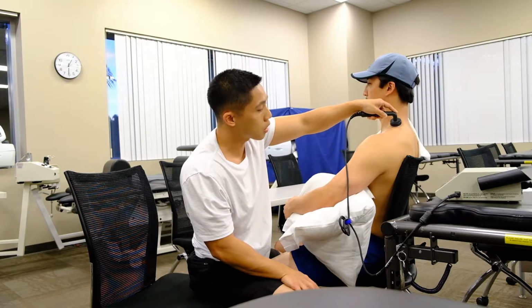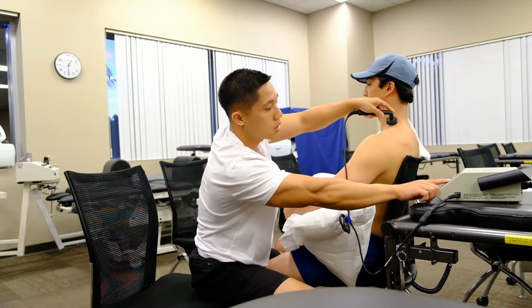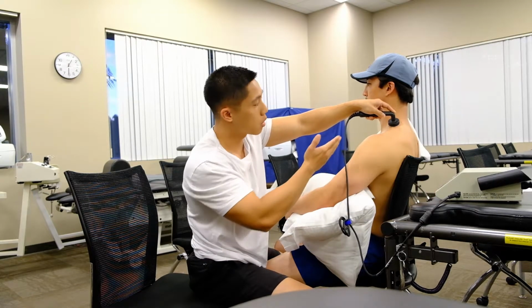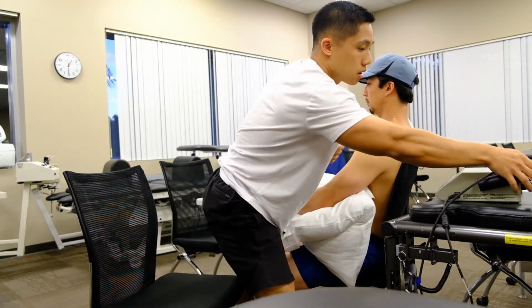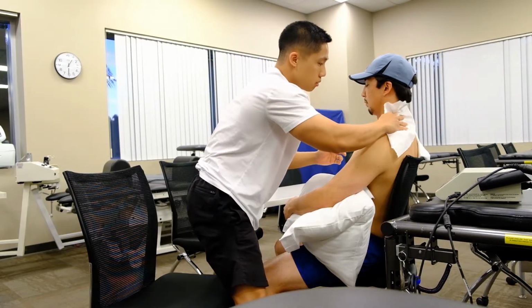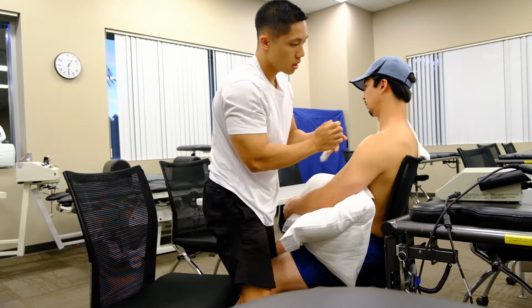And so now we're going to go ahead and ramp down and stop the machine. And at this point, I will go ahead and take the head off of the patient. I'll go ahead and wipe the patient down. How are you feeling? Better. Better? Excellent. Glad to hear that.